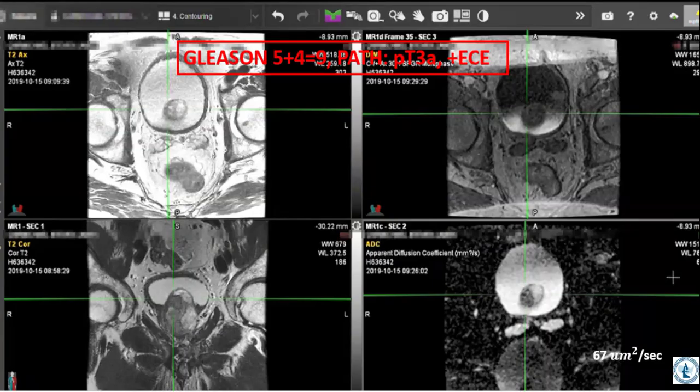This patient actually came to me after 2 different MRI fusion biopsies by 2 different urologists. Now his PSA had increased to 39. And we were very fortunate to identify that the minimum ADC value of 67 was present in the intravesical prostatic median lobe. I performed a transrectal MRI fusion guided biopsy, and we identified this tumor, and the patient had a prostatectomy and showed gross disease extension.